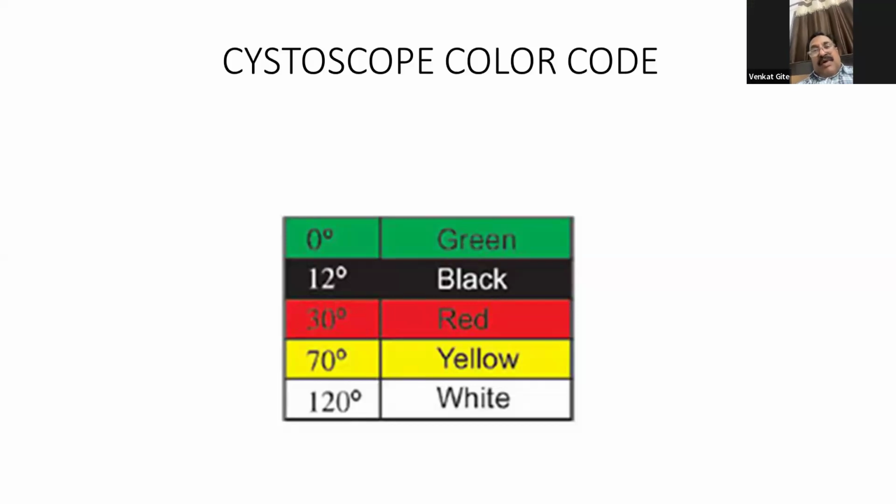So the angle is wide in a Hopkins 2 or Hopkins 1, and in the conventional system it was narrow angle. Narrow angle means only as much as is in front will be seen; if you take a 30° telescope, only 30 is seen. In Hopkins 2 the angle is wider, how much more is not written anywhere, but wide angle means Hopkins 2. I agree with that part. Yeah, Hopkins 2 becomes wide angle.